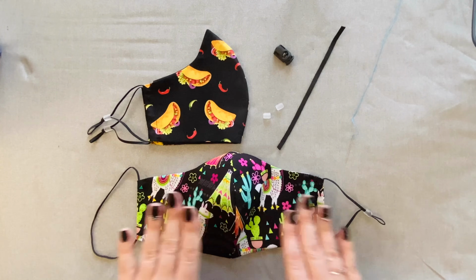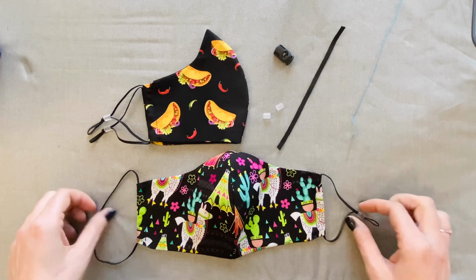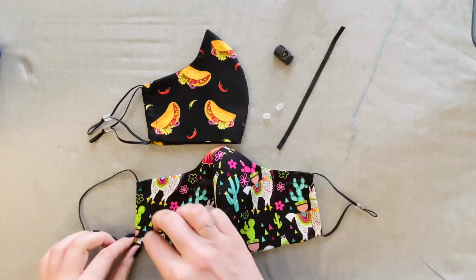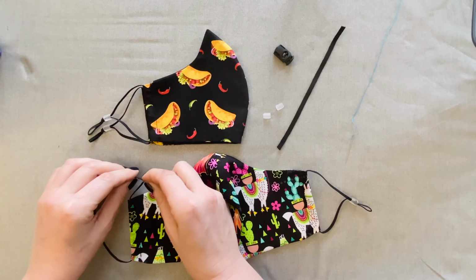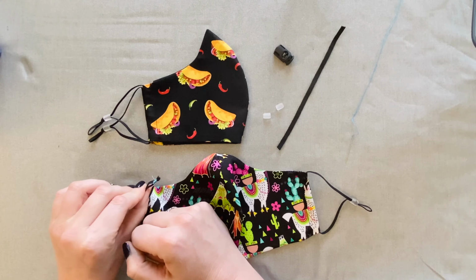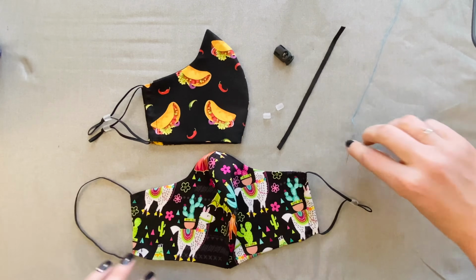So here I am with my mask done. I've got my casings on the side, and I've got my elastic already through the casing. I'm going to pull this through just to show you. I did sew the elastic closed, and I'm going to go ahead and slide that back into the casing.